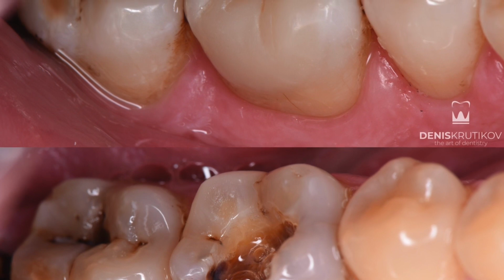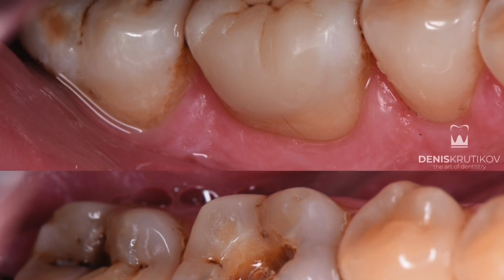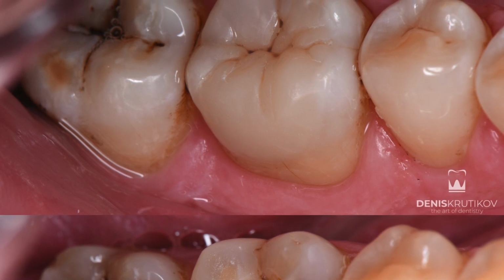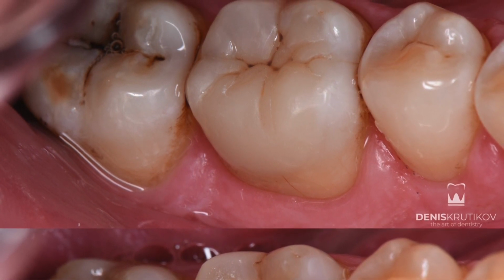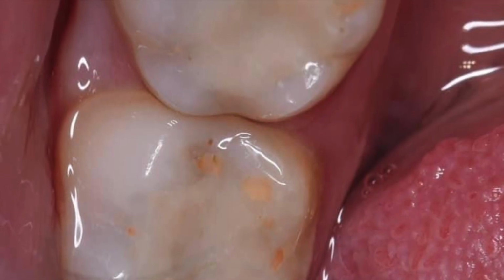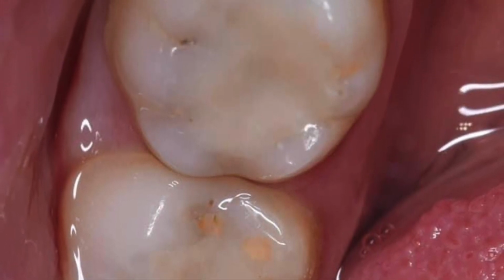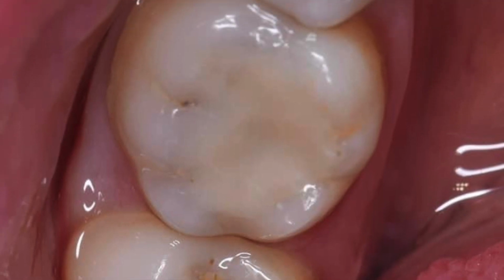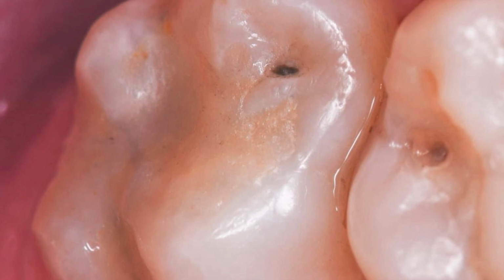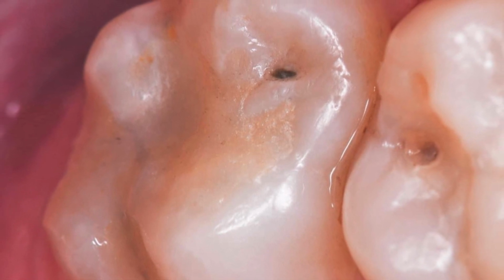Dear colleagues, almost every dentist who creates a direct restoration of a posterior tooth faces a problem. During the final occlusal correction of the chewing surface of the restoration, the correct morphology turns into a smooth, flat surface. Is it possible to create the correct tooth morphology and precise intercusp contacts without grinding them off at the final stage of the restoration?